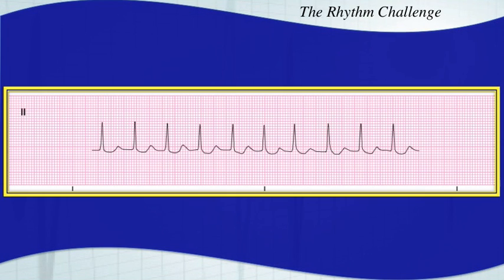Here's your next arrhythmia. Make sure you hit pause and try to give a good interpretation. This is a junctional tachycardia — no obvious atrial activity, or no P waves before the QRS complex. They have a narrow QRS complex. It is a very regular rhythm. Junctional tachycardia, greater than 100 beats per minute.